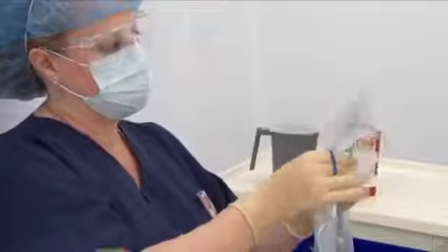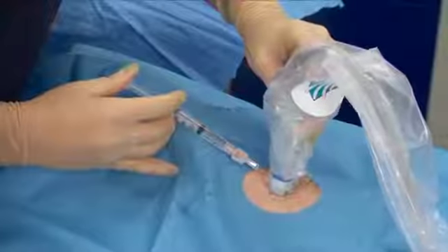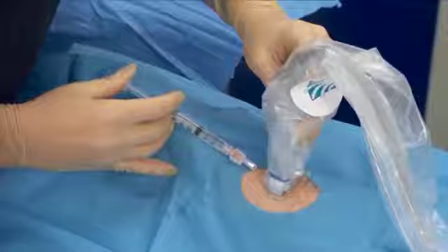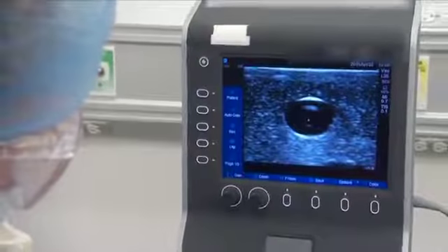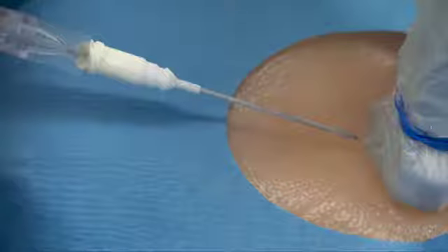Once covered, the probe needs to be maintained on a sterile field. Administer local anesthetic when indicated. Use the ultrasound when available to visualize infiltration of local anesthetic at the intended insertion location. Using the ultrasound, identify the artery. Puncture the vessel using a continuous, controlled, slow forward motion.